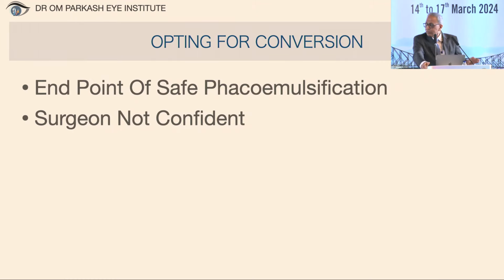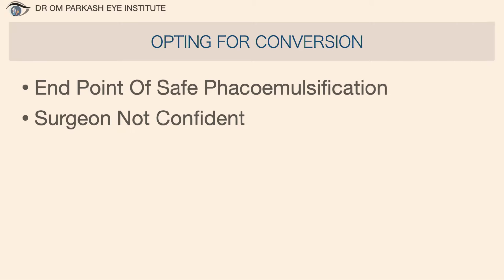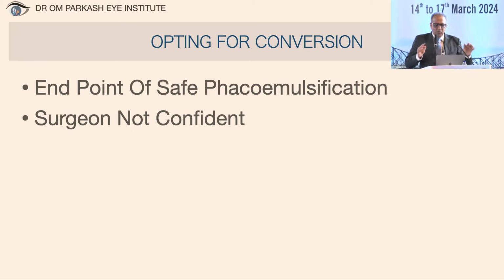Another thing that you did in this video was, because it was a hard cataract, normally what we do is we divide all into 6 to 8 pieces, but what you did strategically, you took out one piece to decompress the bag so that you had a good space to prevent any stress on the bag also. Yeah, absolutely correct. So that is a small trick which should be added in your strategy.